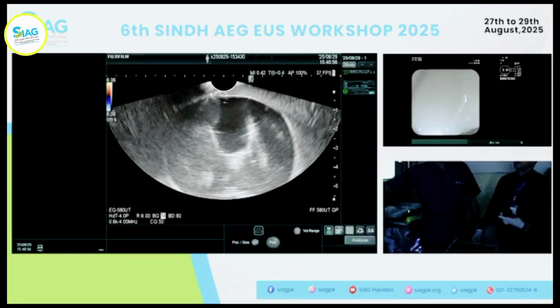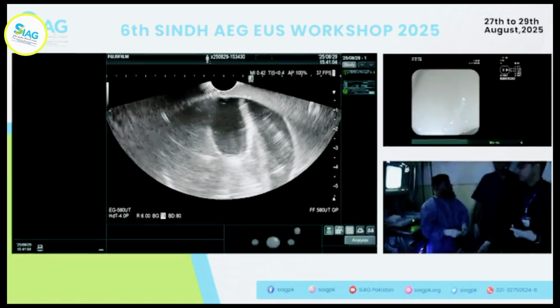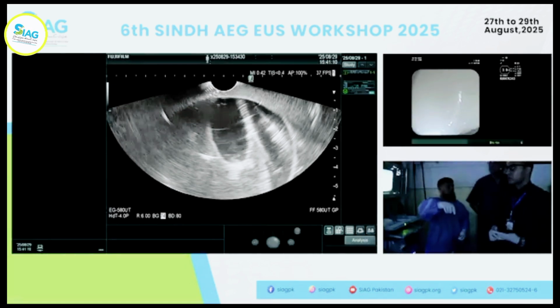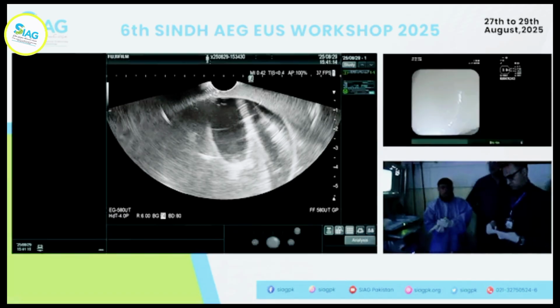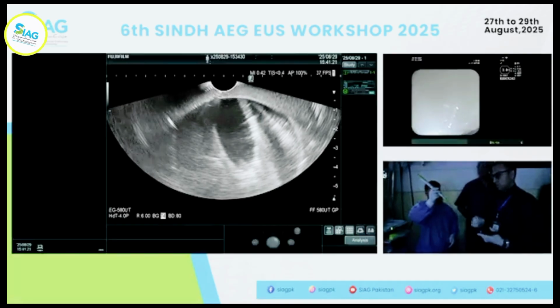For heck of it, there is no flow. That should be a standard thing. And you want to bring your needle out. Give him the needle. हाँ 22 कोई भी दे दो, मैं आप लीव कर। हाँ, these are good. Khalid, how do you think the view is? View is pretty good actually for the FNA at least.